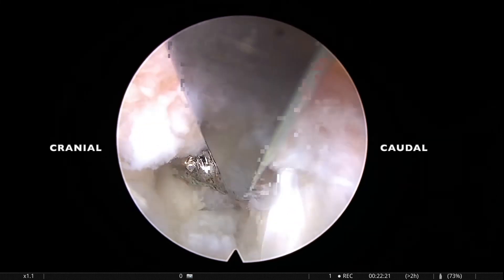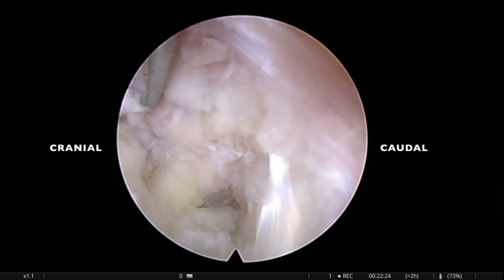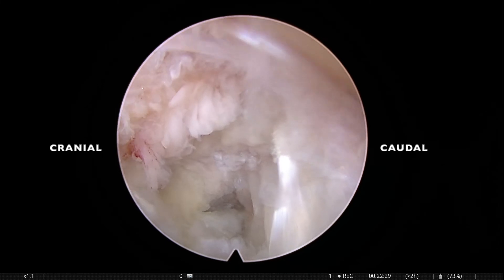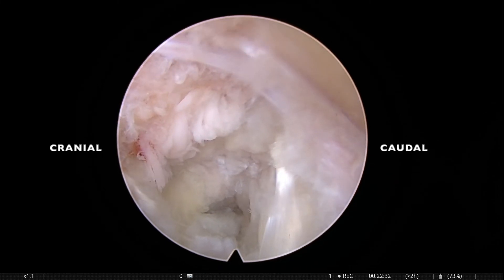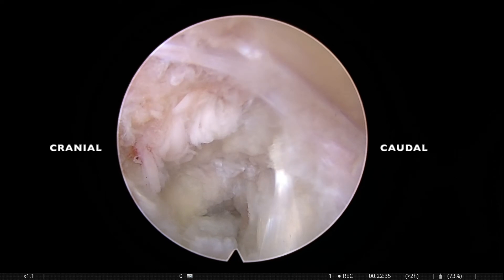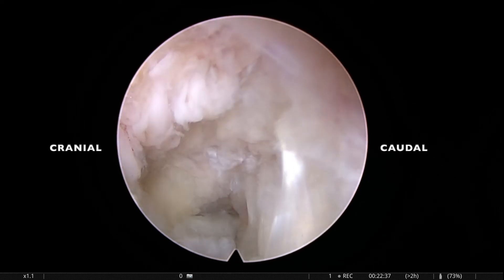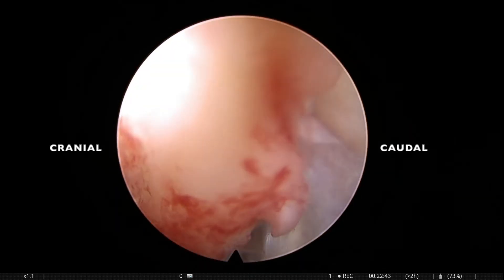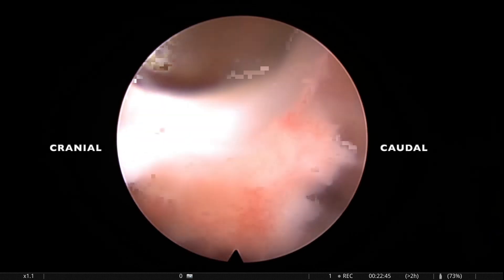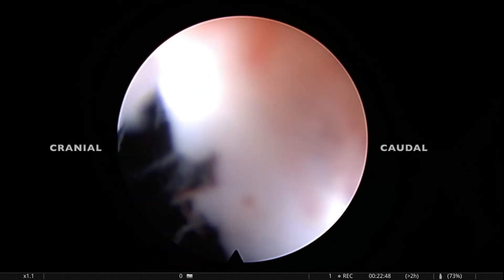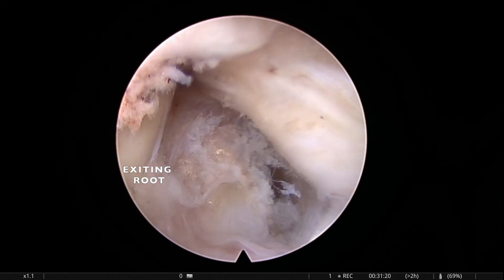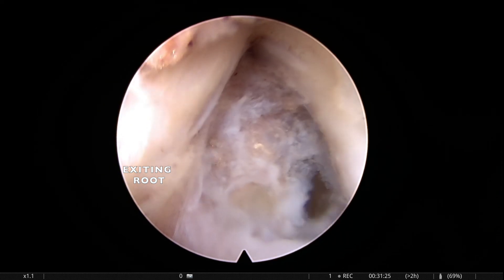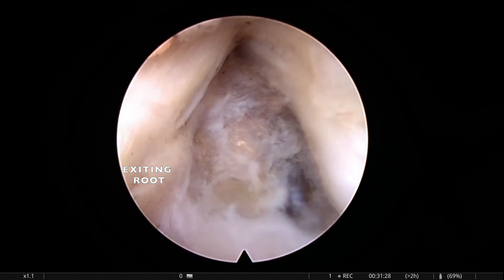You can see a fragment hooking out of the annulus — an extra-annular fragment lying just below the fibers. That fragment is grabbed and removed. Once this fragment is out, hemostasis is attained and the area is again checked for any fragments. The exiting root is now nicely visible at the 9 o'clock position.